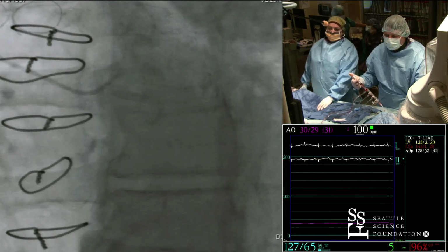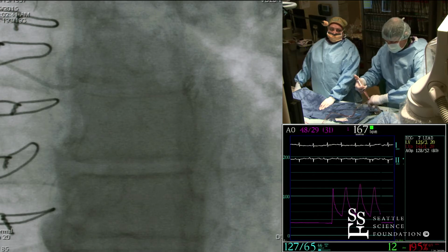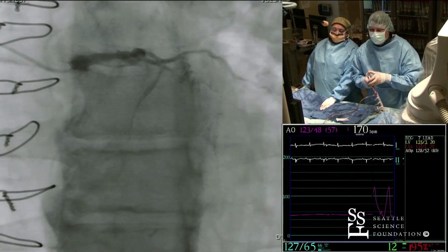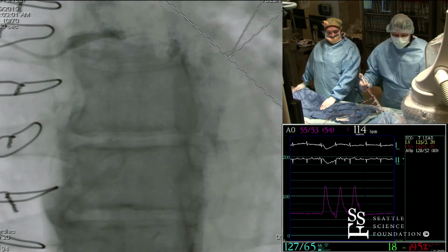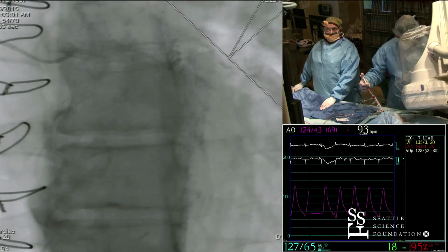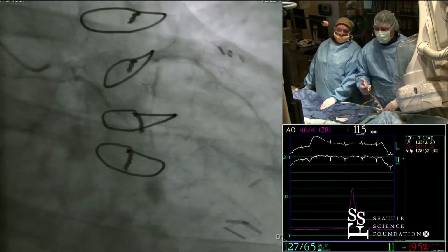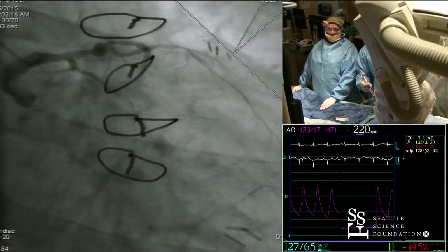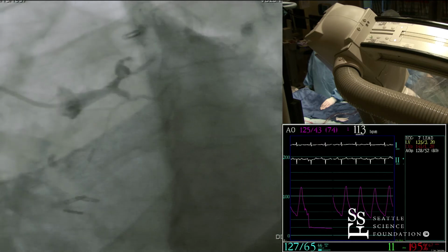We don't use JL3.5 usually for interventions. We use an XB 3.5, or we'll use a CARI or AL1. Almost never would we use a JL shape for intervention. So we got in nicely, and the tip is down, which is good. 20 of RAO and 20 of caudal. Well, the IMA's open. That's good. The problem with people who use 4s is that it's really hard to fill the coronaries adequately, and sometimes you don't know whether there's a lesion or whether it's just streaming. It's kind of angiography 101.